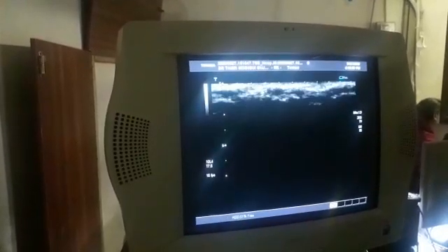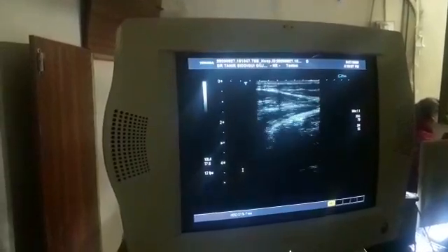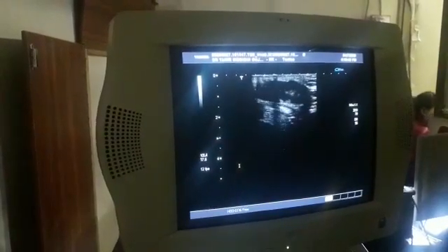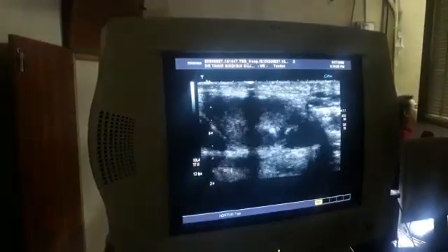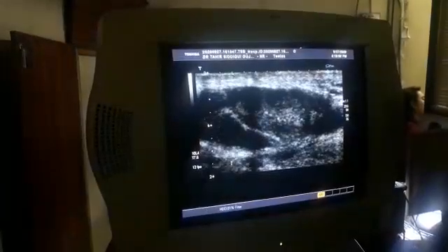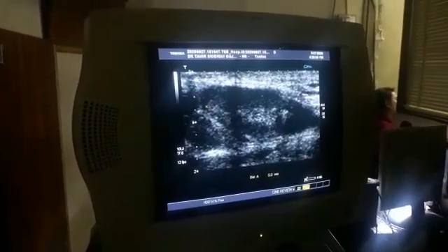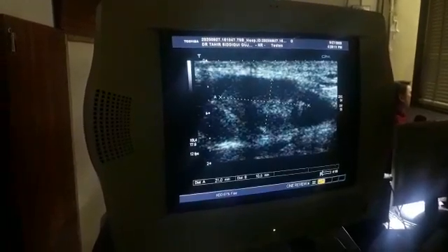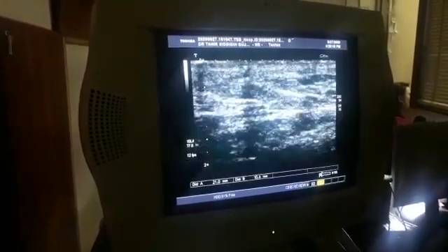Now I am moving the probe towards the left inguinal region, and in this area I was very lucky — I got the left testis in this region. This is the left testis, now visible in the left inguinal region. You can see it measures approximately 21 by 10 millimeters, hypoplastic and small in size.